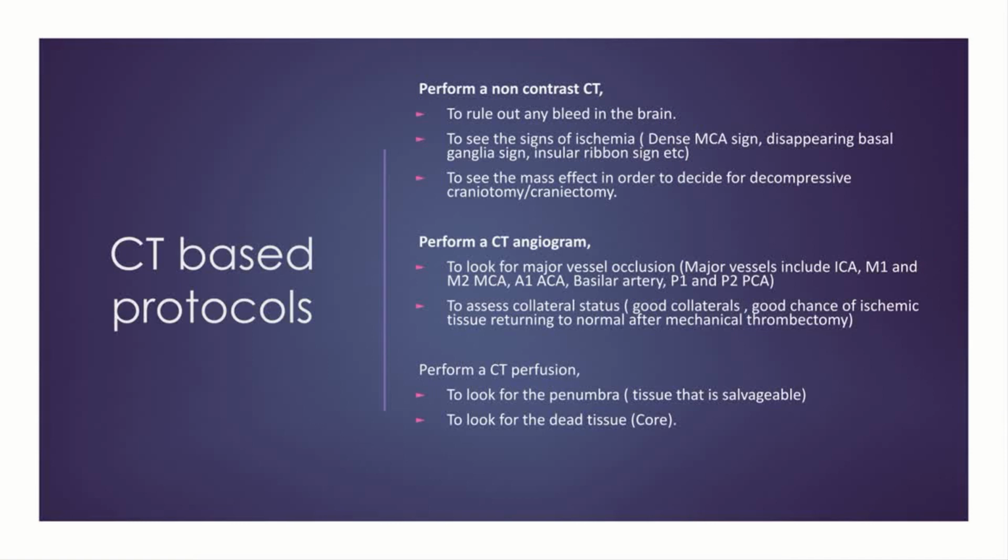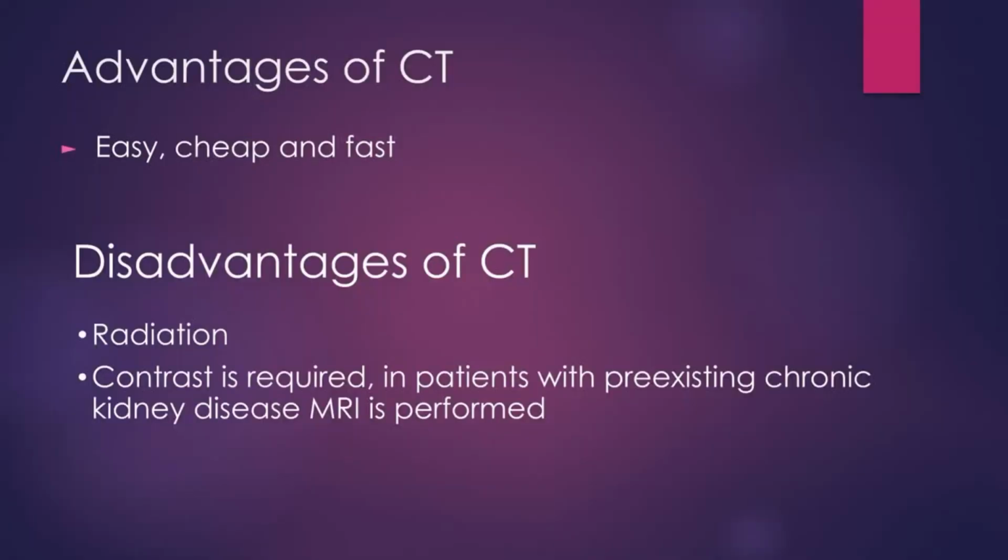You perform a CT perfusion to look for the penumbra, tissue that is salvageable, and to look for the dead tissue, core. Advantages of CT is that it is easy, cheap and fast. Disadvantages are radiation exposure and contrast requirement, which is a problem in patients with CKD.